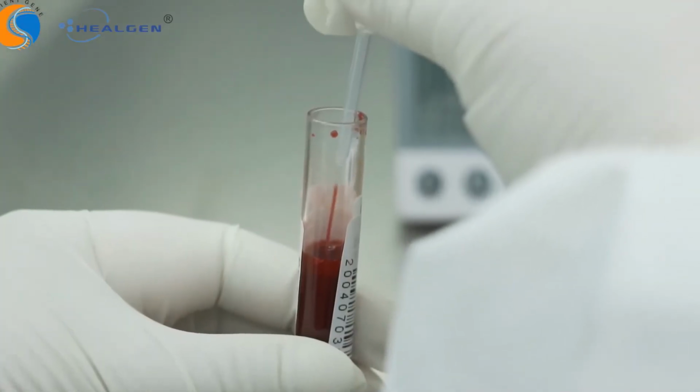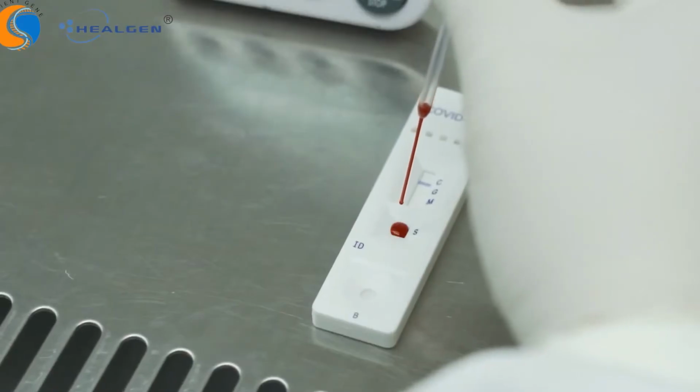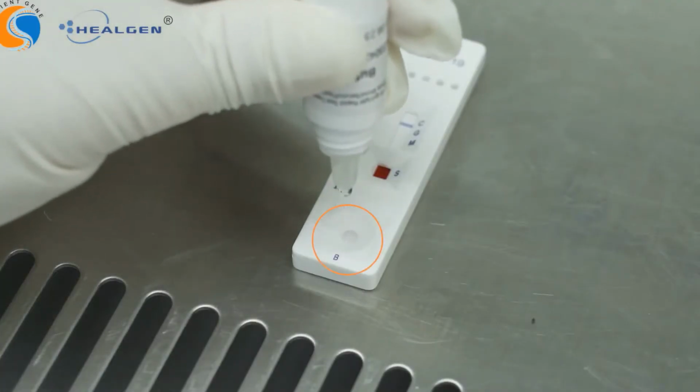For whole blood specimen, draw the specimen into the dropper. Hold the dropper vertically and transfer 1 drop of whole blood to the sample well. Then add 2 drops of buffer to the buffer well immediately after.